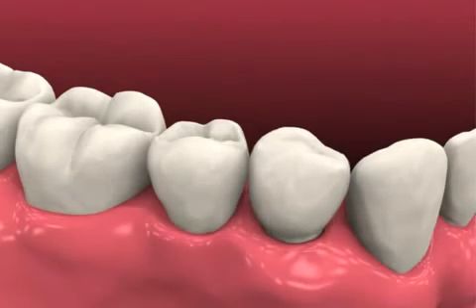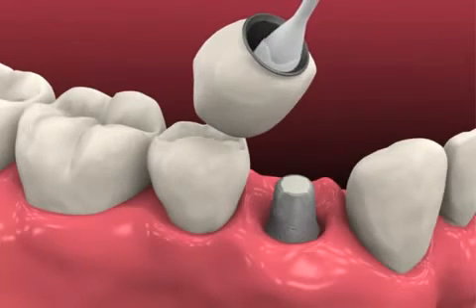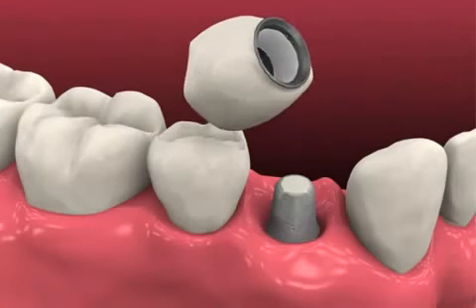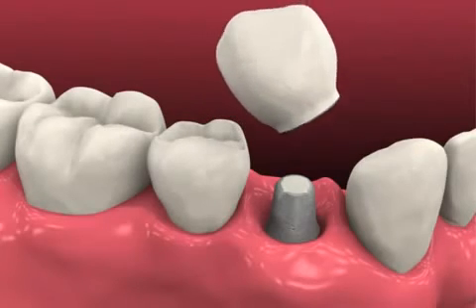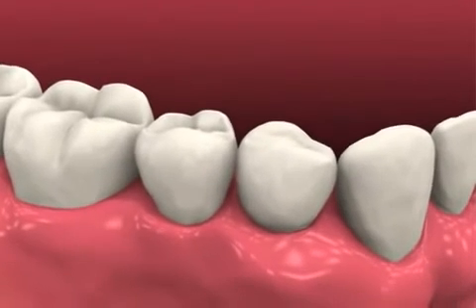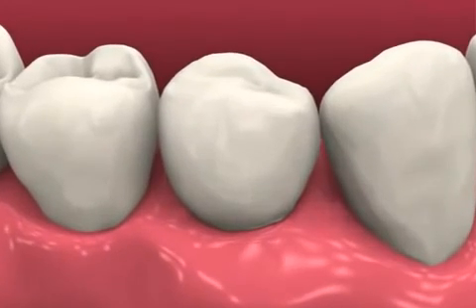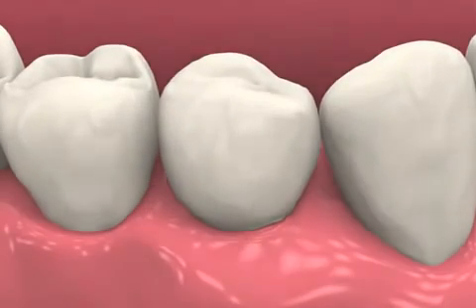Seat the prosthesis and confirm fit and contour. Check occlusion and modify if necessary. Line the inside margin of the prosthesis with a thin layer of soft access cement, seat the prosthesis, and remove any excess cement from the sulcus. Take a radiograph for prosthesis delivery records and dismiss the patient with home care instructions.